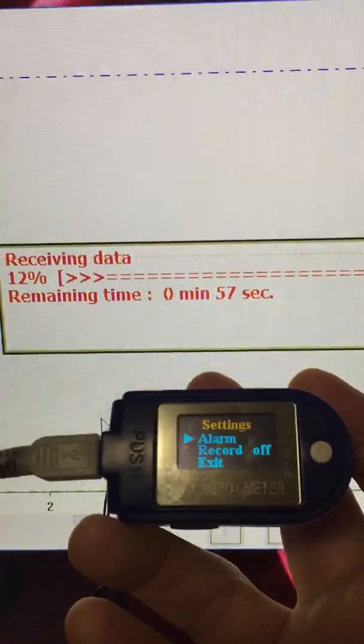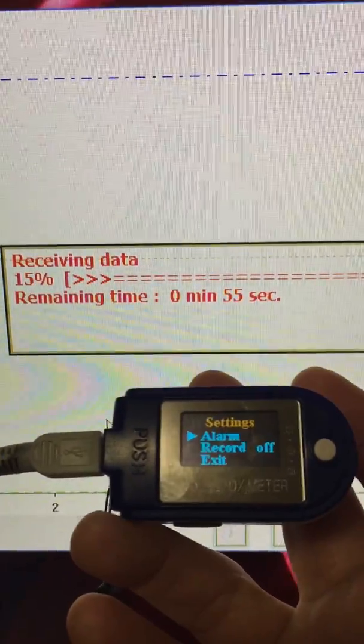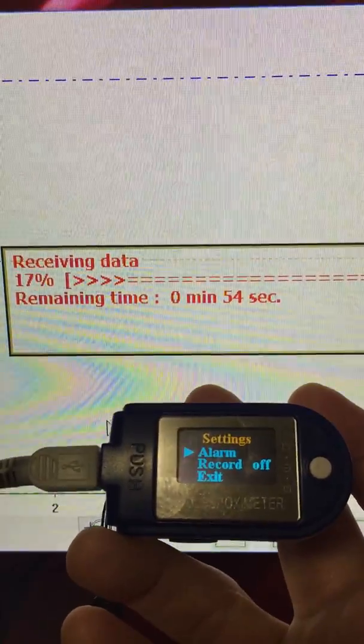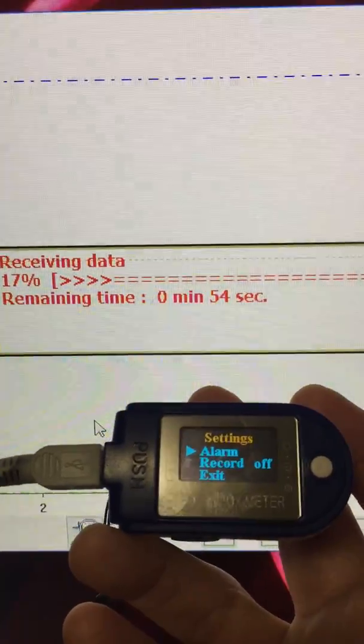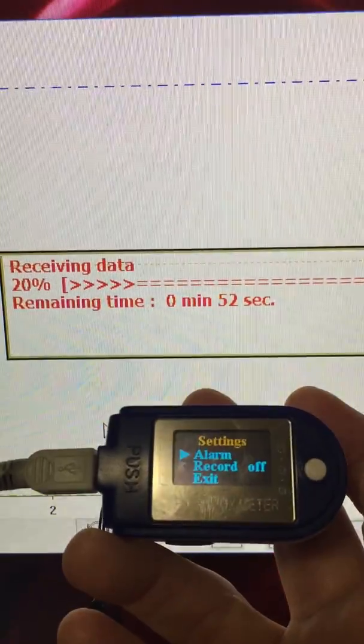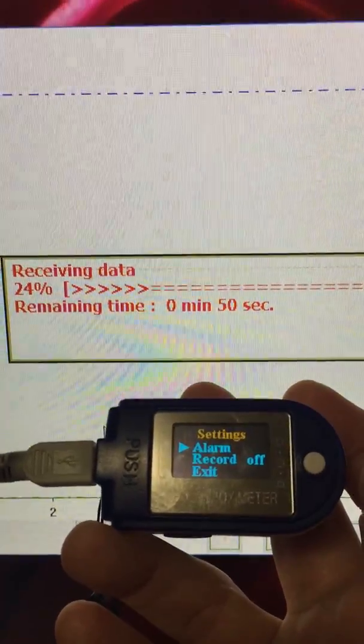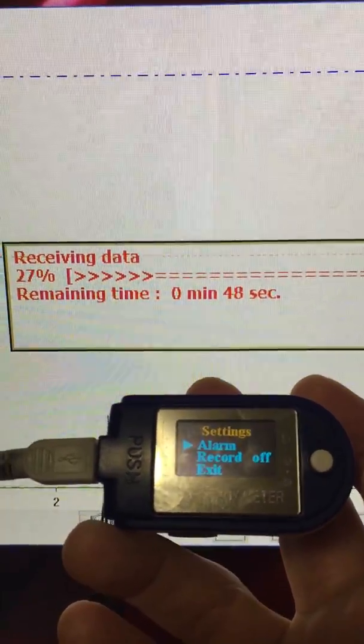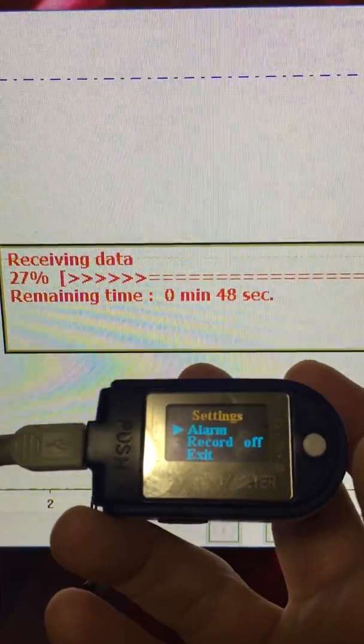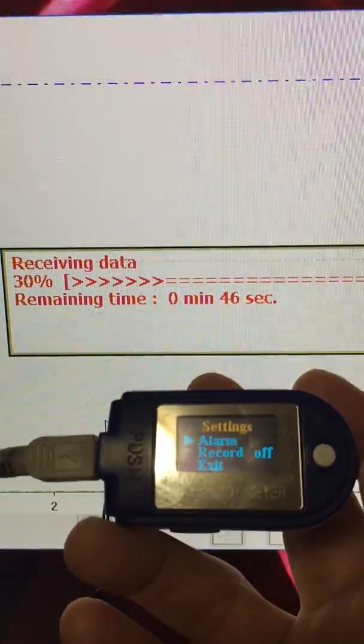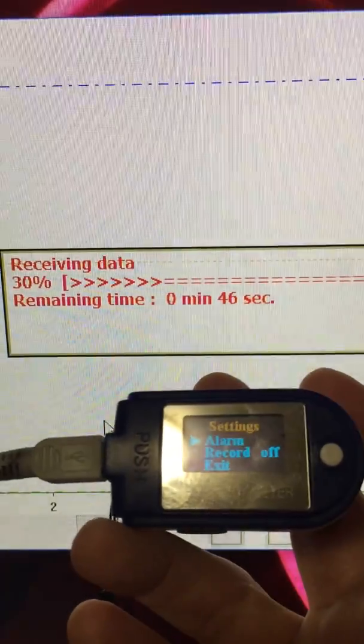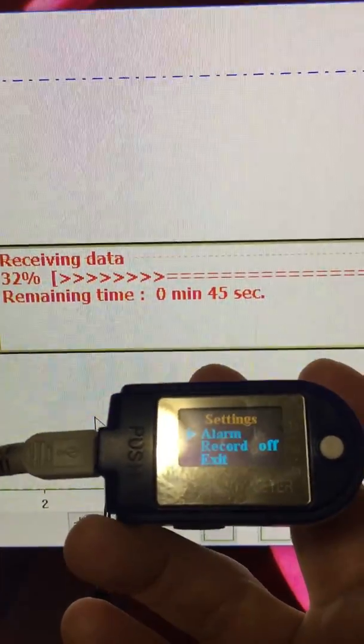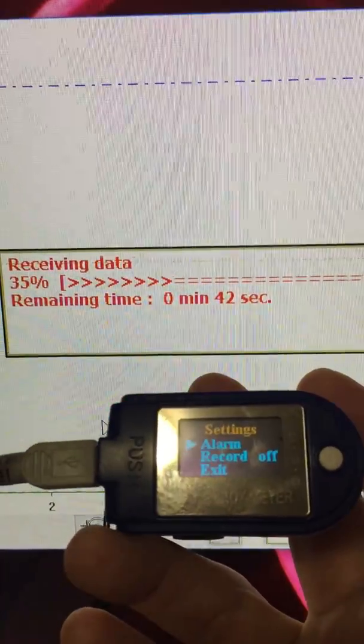Takes only about a minute to download the data. Then you can see a nice time graph of your oxygen levels. I've been using it to check for sleep apnea.